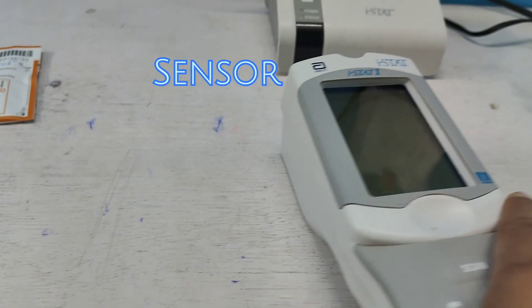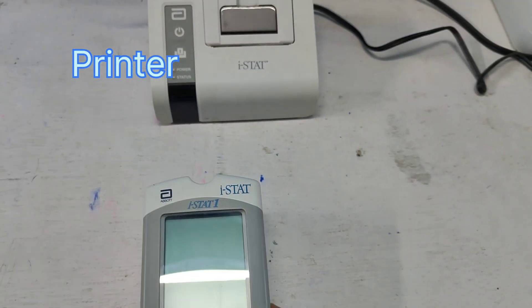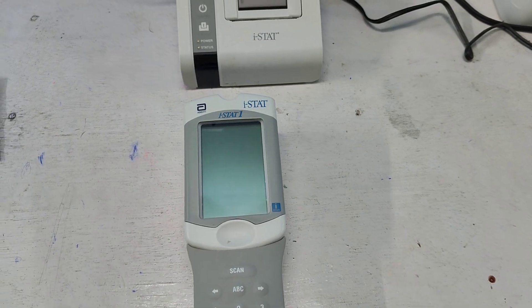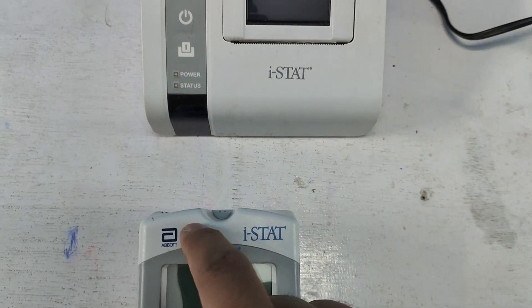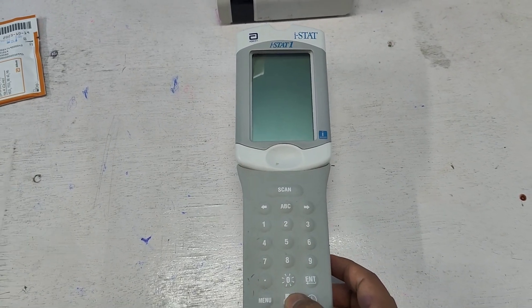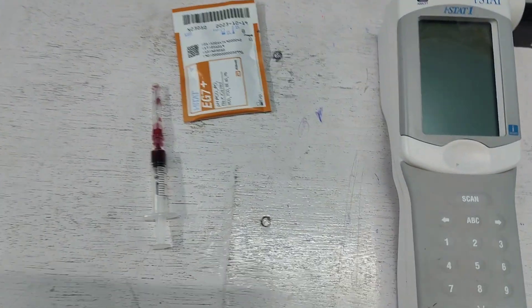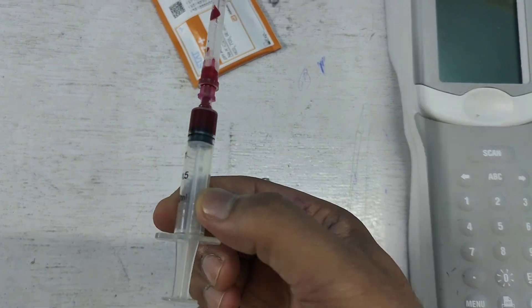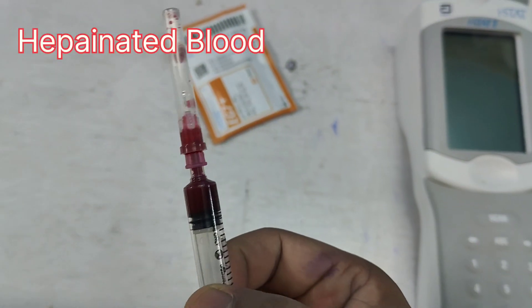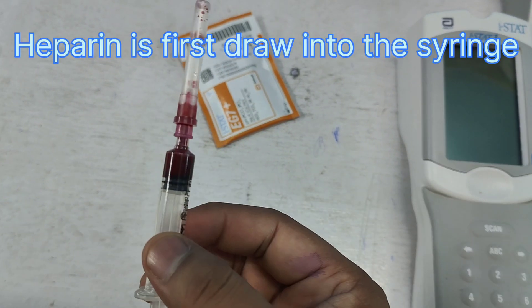In the head portion you can see the sensor, by which it senses the printer. Here is the printer sensor. After placing the machine near the printer, you can print by pressing this button. Here is the heparinized blood — the heparin is first drawn into the syringe, and after that the blood is collected from the artery.